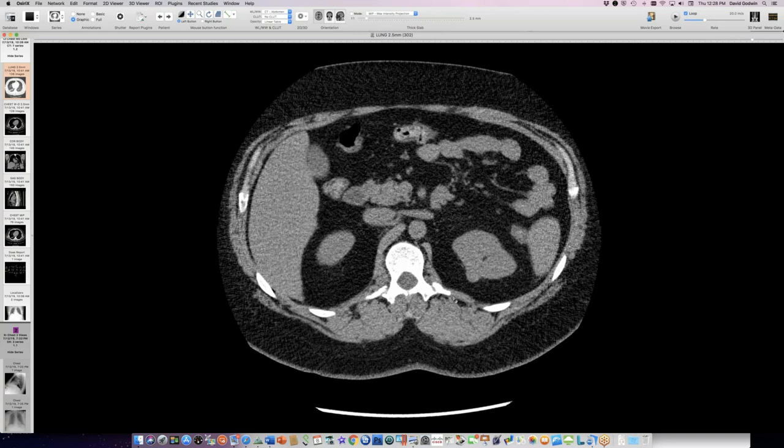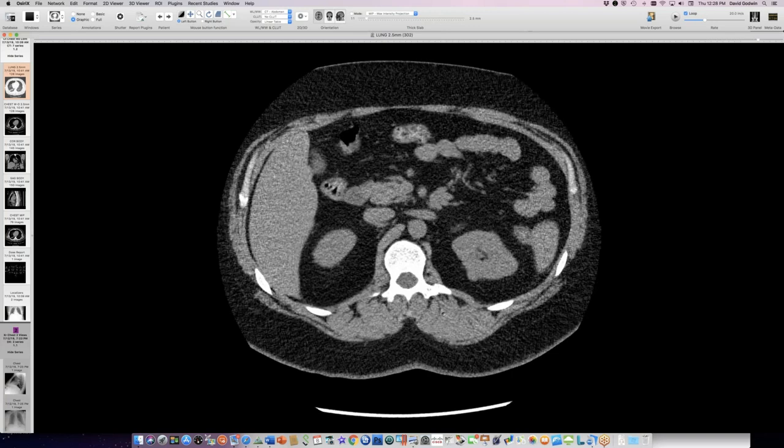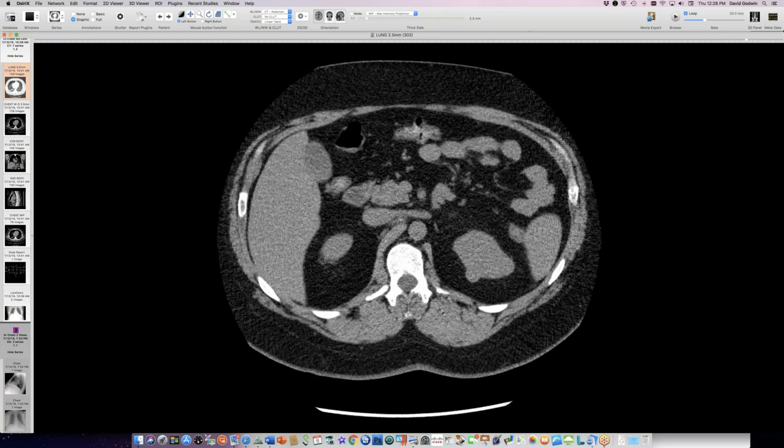Chromophobe. Okay. Is it chromophobe? Yes. Was that true? Or maybe that's an endocrine tumor. I think Birt-Hogg-Dubé is associated with clear cell and oncocytomas, but both peak enhance in the corticomedullary phase, not nephrographic. So I thought that was kind of peculiar that it had a delayed enhancement.